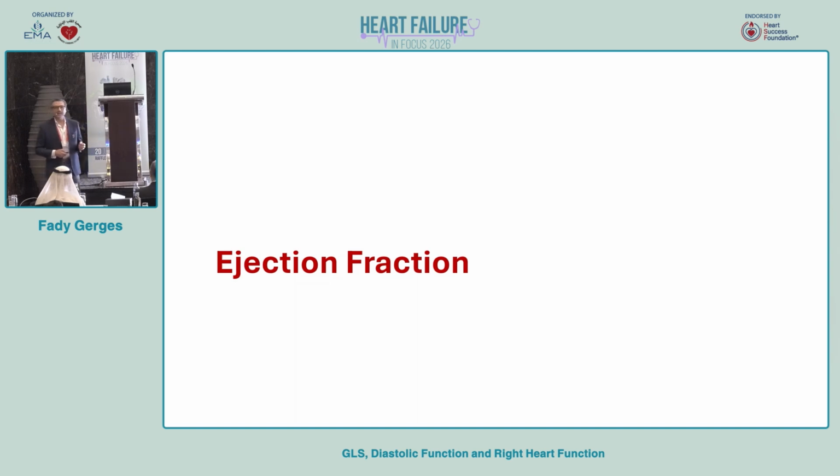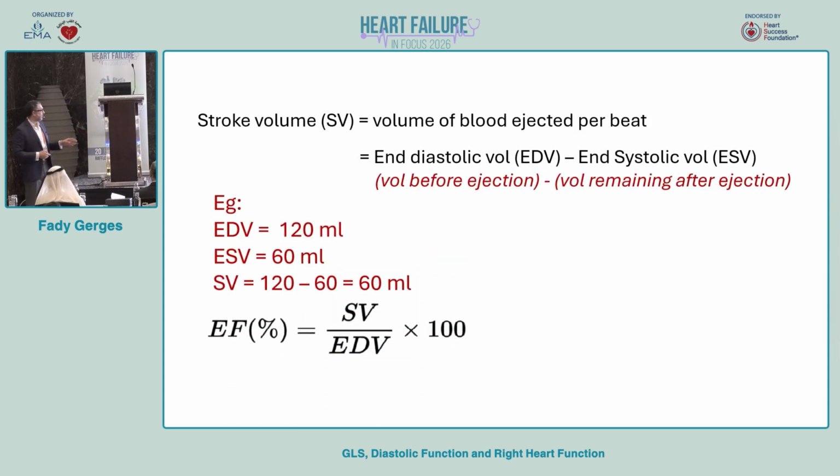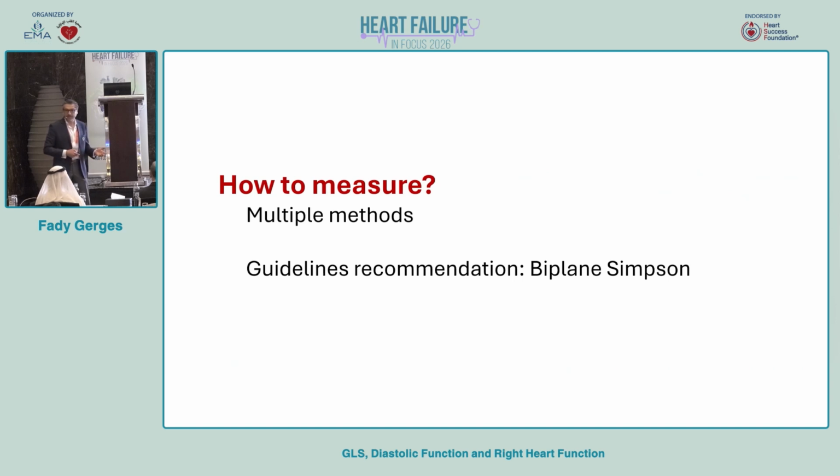the ejection fraction. For many patients who have HFpEF, amyloidosis, HOCM, or subclinical dysfunction after cancer chemotherapy, we cannot get a really precise ejection fraction. Simply, the ejection fraction is a small calculation: stroke volume divided by the end-diastolic volume, in percent. So it's a very easy equation. The thing is that we have a lot of ways, multiple methods or parameters, to get the ejection fraction.